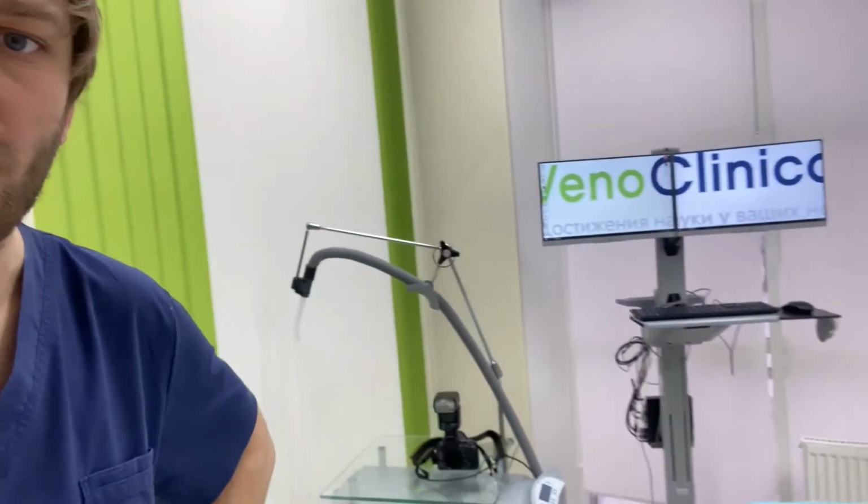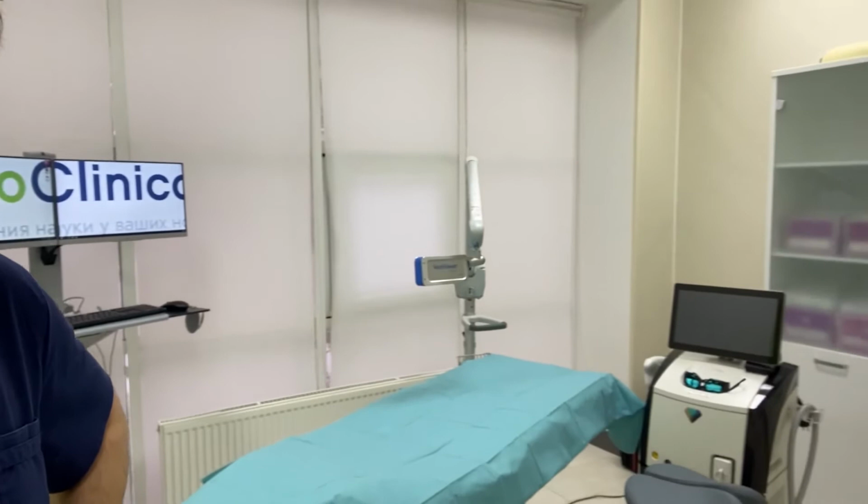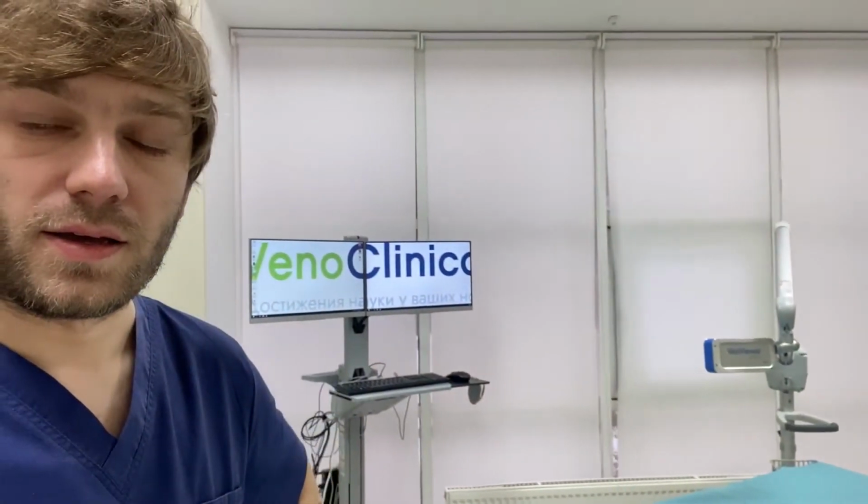Dear colleagues, my name is Denis Borsuk, and in this video I want to show you our settings and how we do the CLaCS procedure. Firstly, I want to show you the settings in our room for CLaCS therapy. Here is the standard cabinet, standard room, and we have here, as always, the setup for CLaCS therapy following Kazuo Miyake's protocol, which we have been using for the last year.